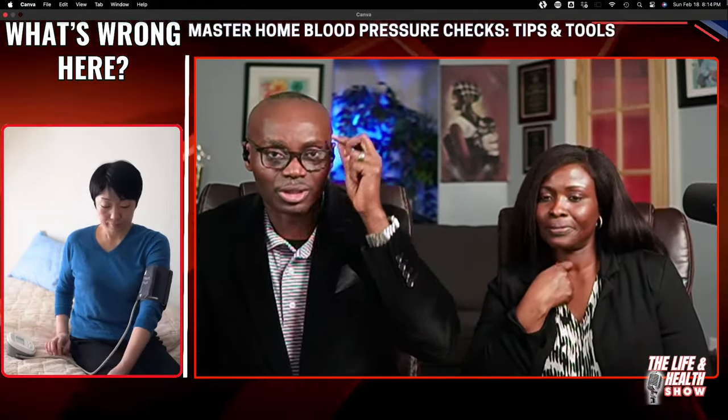I think somebody may say, oh, I just want to take a quick reading. If you're taking a quick reading, it doesn't mean you should do it wrong. You have to do it right. Otherwise it will still be wrong, and that will be a waste of your time. You did it, but it's still wrong. You can get a good number from here, especially if the cuff is so loose. It's going to give you something that looks good, and it may be bad. If your machine is good enough, the machine sometimes will tell you that the cuff is not tight, and you have to do it over.